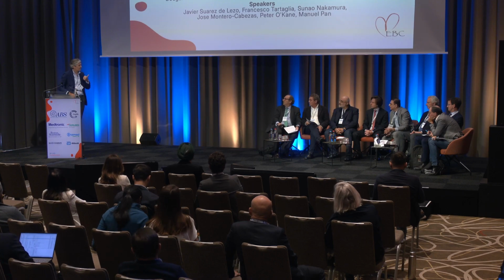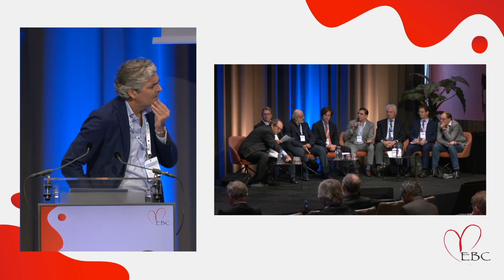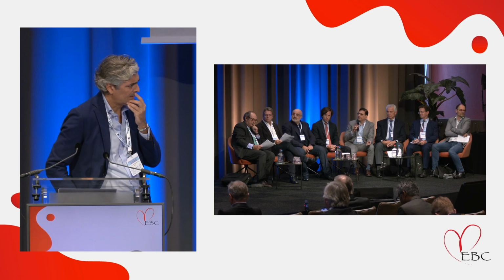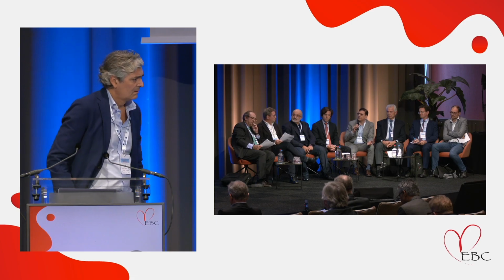So the first question is about physiology? The first question was that since most of the cases that you showed had an isolated ostial LCX disease, do you think it would be important to do an FFR prior to intervention because you're jailing the LAD? Yeah. How many cases had a fractional flow reserve done prior to intervention?